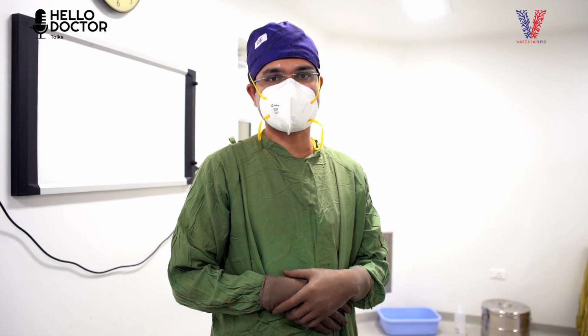After completion of the procedure, we give a compression bandage to the patient and give him rest for about 20 to 30 minutes, and he can walk after 30 minutes and go home. So this is a daycare or outpatient procedure, completely scarless and under local anesthesia. No fasting or anything is required for this patient after the procedure.